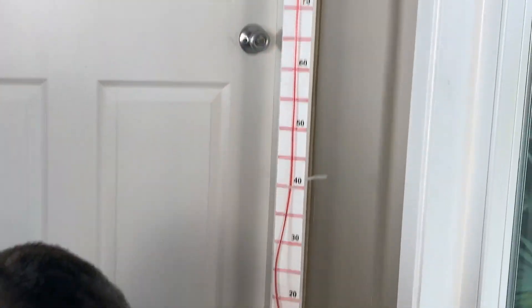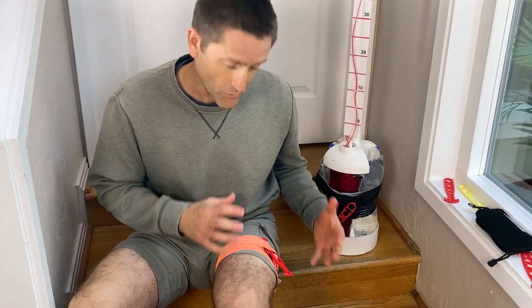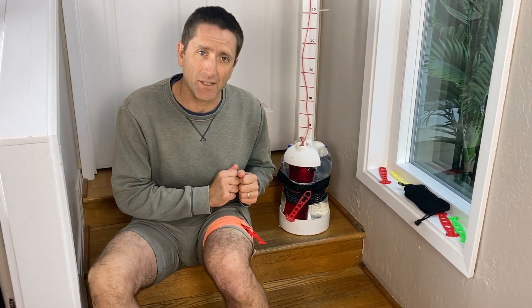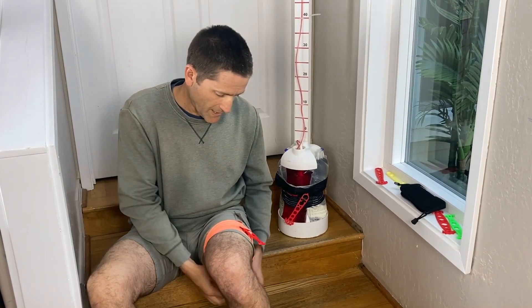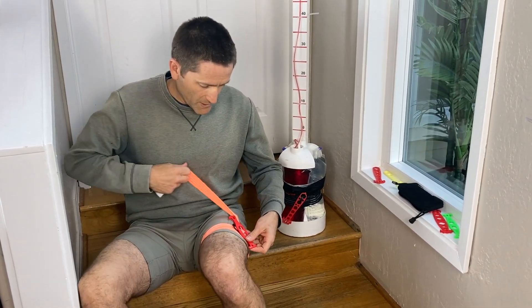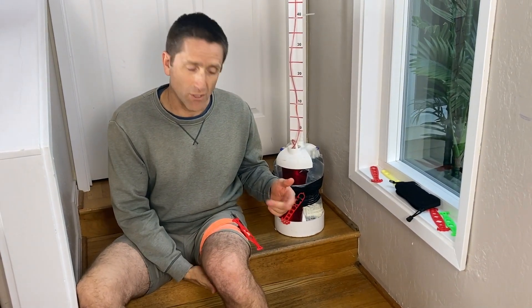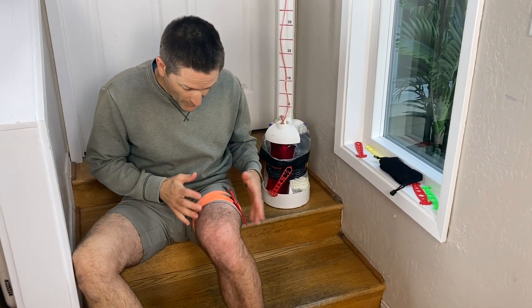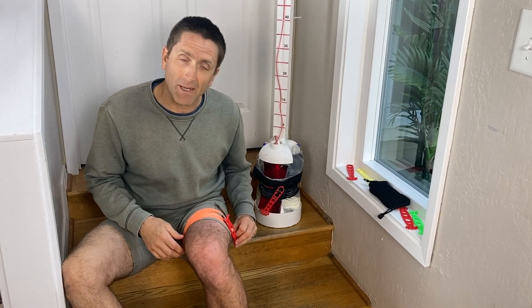Releasing that — this does not hurt nearly as much as most tourniquets because I have wide pressure and the anti-pinch plate, so my skin is not stuck in there. And once bleeding has stopped, I'm empowered to back it off too. I can remove this and see how it goes — the whole topic of tourniquet conversion goes away this way. I'm releasing it and checking: do I have bleeding or not? If there's more bleeding, I can crank it back up — that's not a problem.